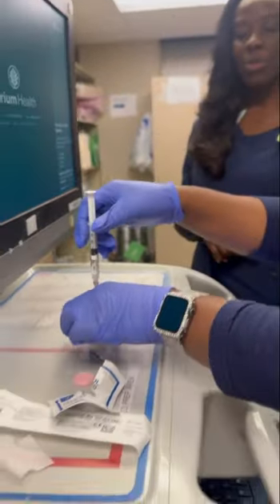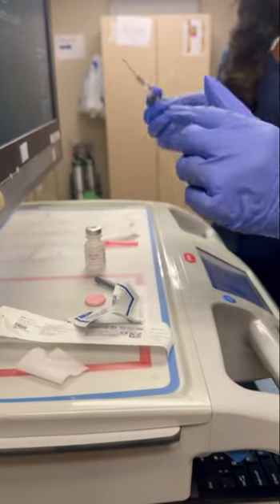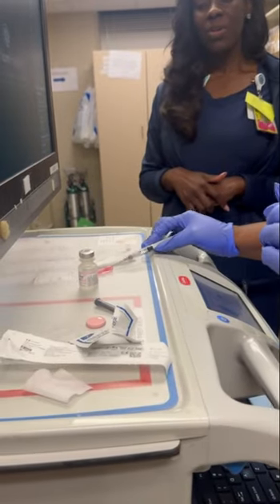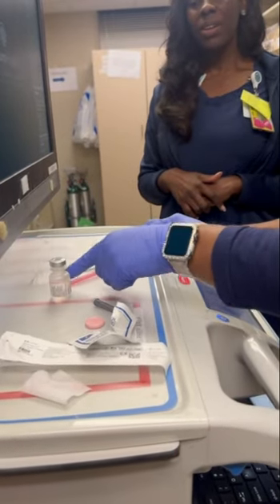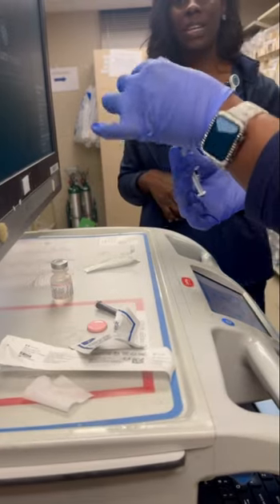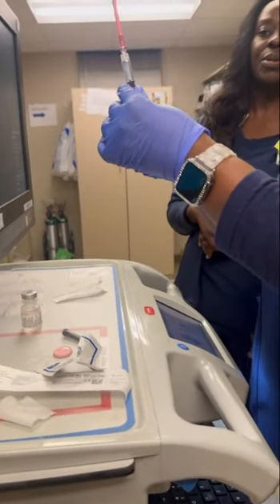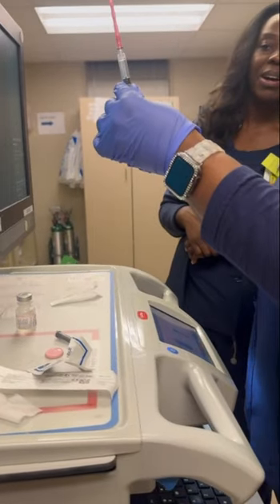At that point we'll remove the syringe and we'll do the one-hand scoop method where you reinsert or recap it. At this time you can adjust it to make sure there are no air bubbles and that you have the appropriate amount to administer.